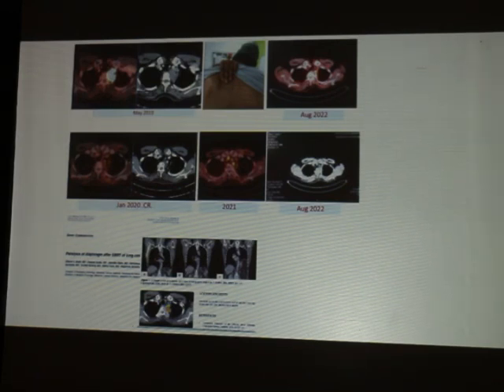The only complaint is he had a diaphragmatic palsy, asymptomatic, since he's an athlete, he can compensate. It's an asymptomatic diaphragmatic palsy which we reported in the Journal of Radiosurgery. So you can see on the extreme right, the left side hemidiaphragm is raised very high. Can you appreciate this? Yeah. This hemidiaphragm you can see on the right side, the liver, left side is raised up. Patient is not aware of the diaphragmatic palsy because he is an athlete, he has compensated.